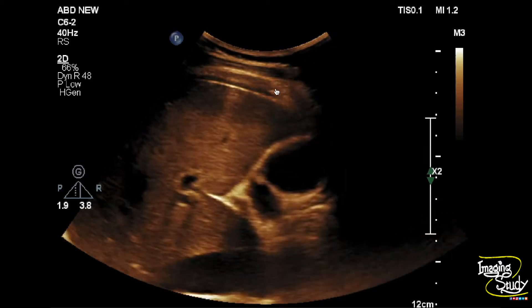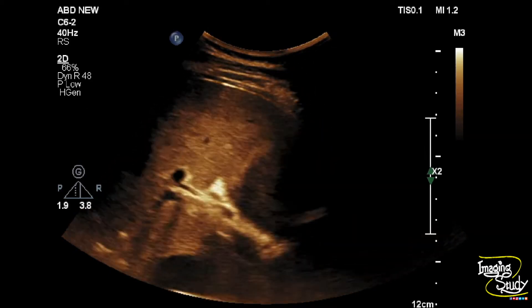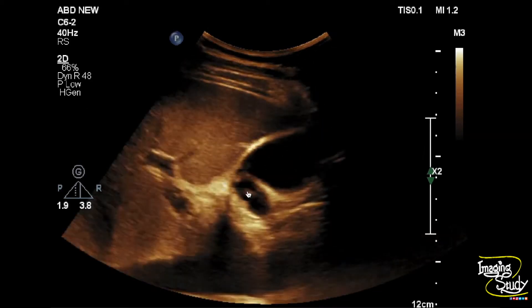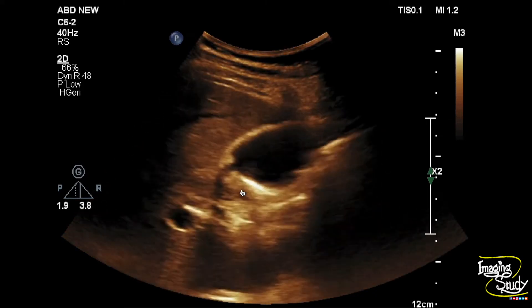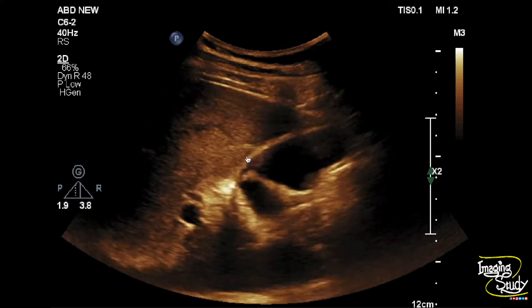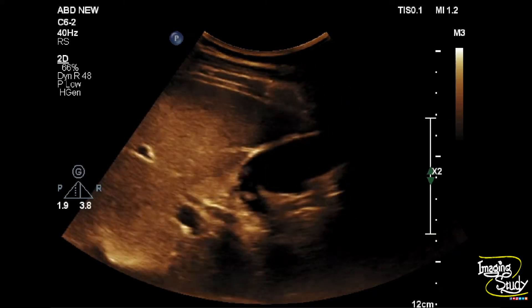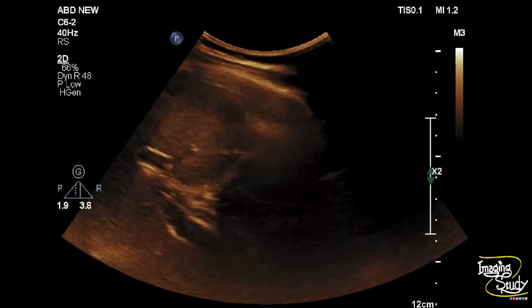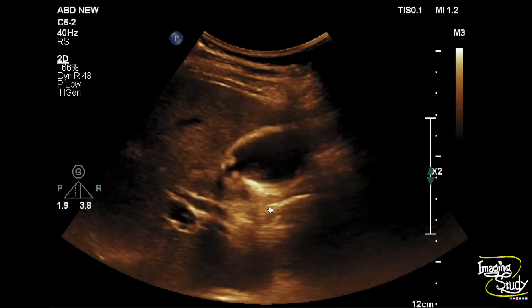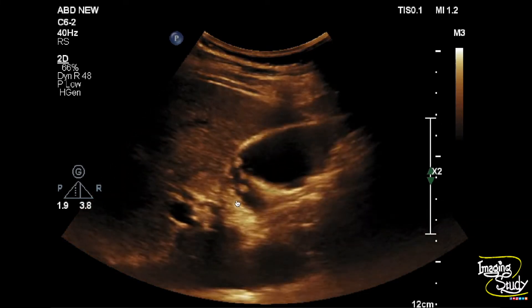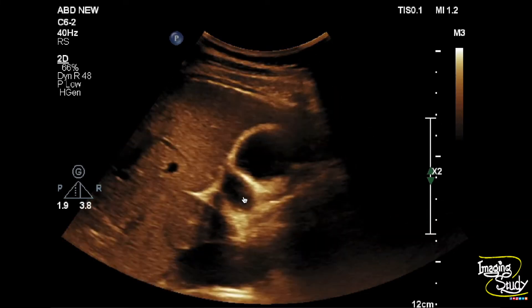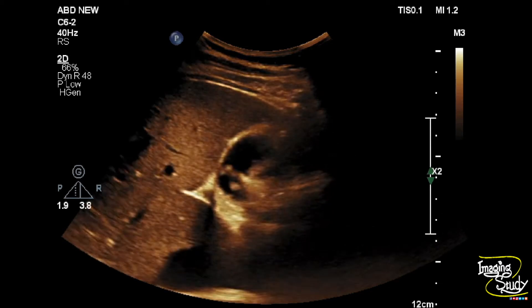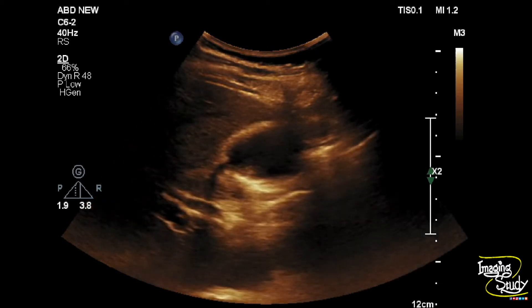Here you can see the longitudinal section of the gallbladder, and you can see multiple hyperechogenic fixed structures arising from the luminal aspect of the gallbladder wall without any posterior acoustic shadows. These hyperechogenic structures are seen at the body and neck region, arising from the mucosal layer.